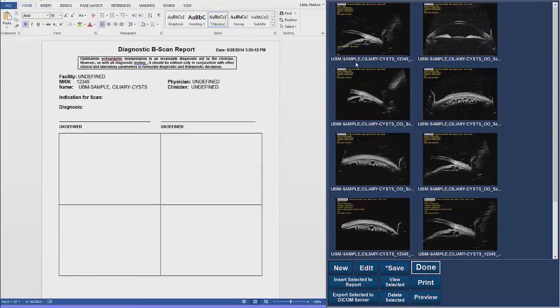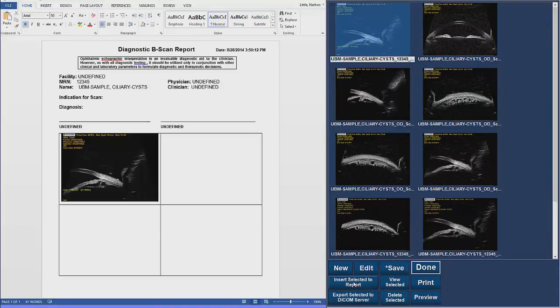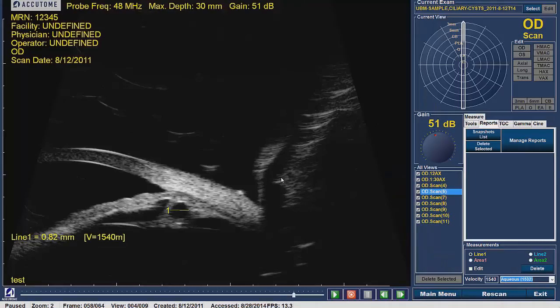In order to import an image, select the image from the right-hand side of the screen and click on it. The image should become highlighted in blue, then click on Insert Selected to Report. The image will be moved from the library to the report. Once the desired images are in the report, click Save at the bottom of the screen and the report will be saved and exported to the desired file location. By default, this location is in the Accutome file folder and can be adjusted in the setup screen. Once the report is saved, click Done to exit and return to the patient's Analyze screen.